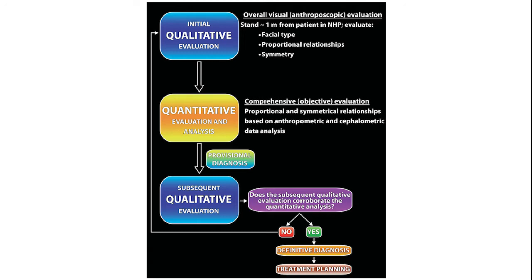Define which craniofacial structures are of abnormal size and or morphology and in an incorrect relative position. Number 3. Relate the abnormal to the normal. Identify which analysis may be used to relate the structures identified in the incorrect relationship to those in the correct relationship. Number 4. Check findings. Identify alternative analyses that may be used to check the craniofacial relationships.